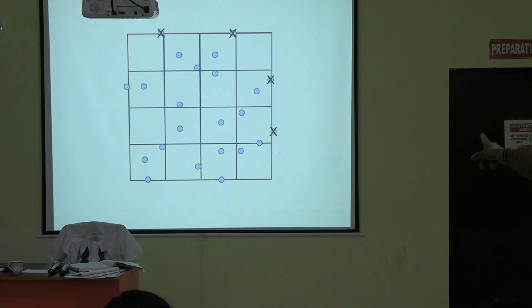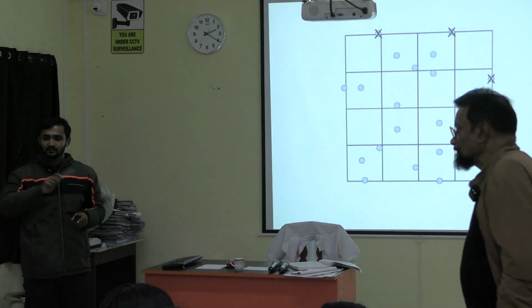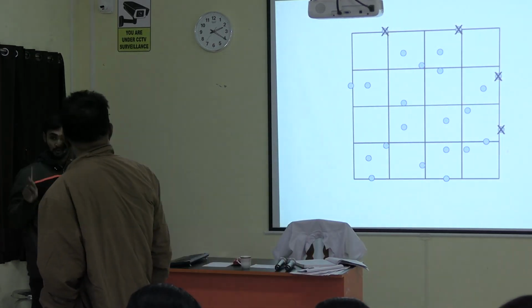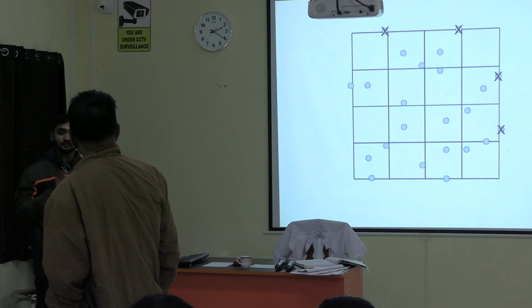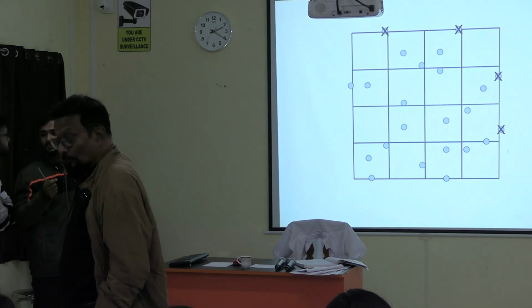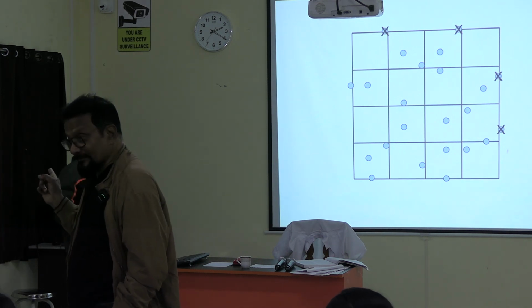1 into 0.1. The large box you have counted, no? But the calculation is about the 4 boxes. So you have calculated in 4 boxes, so you should count all the 4 boxes. So this is 1 box, and 3 more boxes. If you count 4 boxes, the number will be increased and area will also be increased.